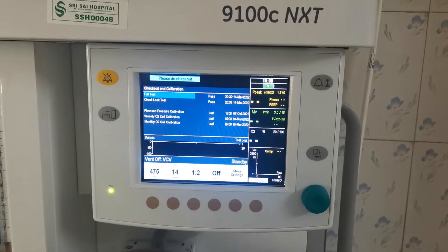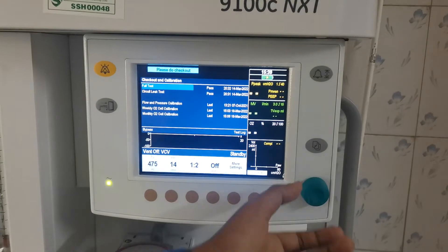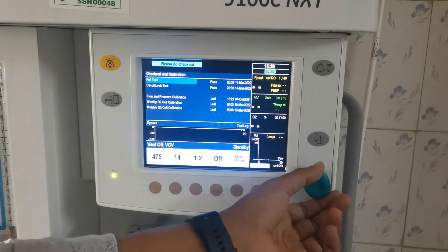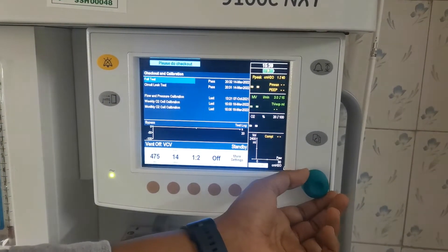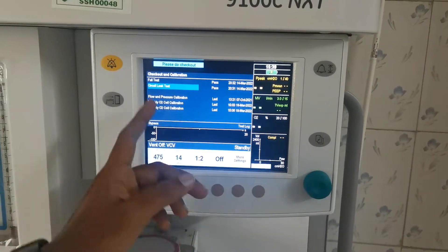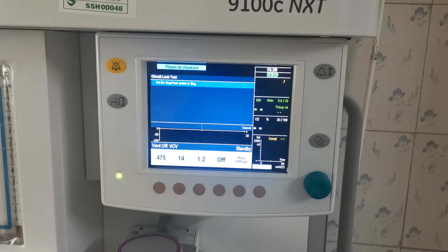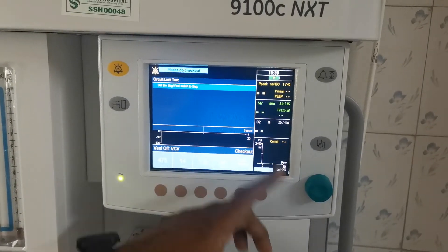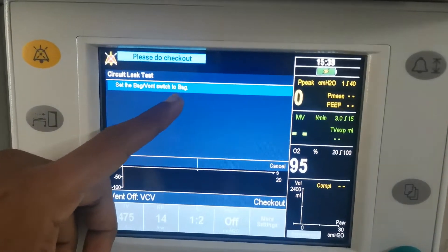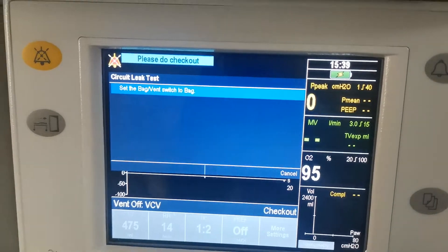Now you have the checkout and calibration. So you can navigate to circuit test. You can press it and it will show: set the Bag/Vent switch to Bag.